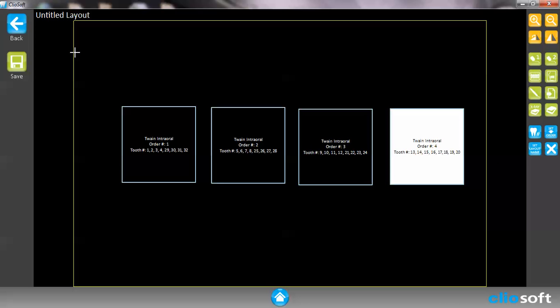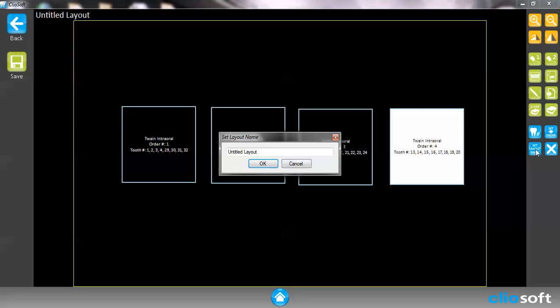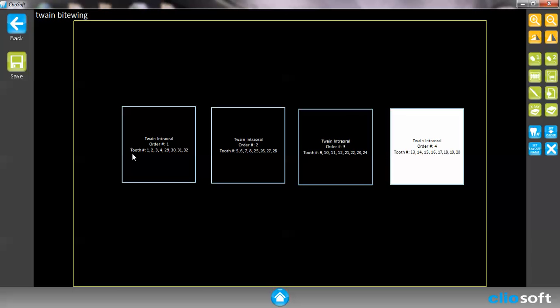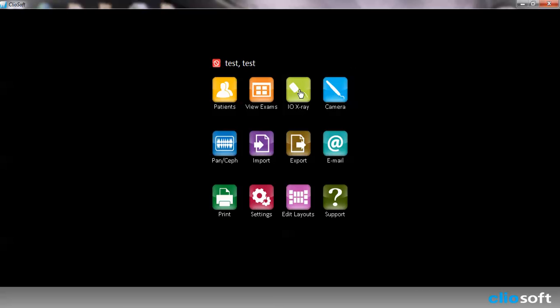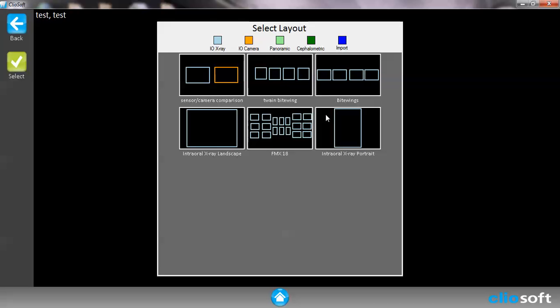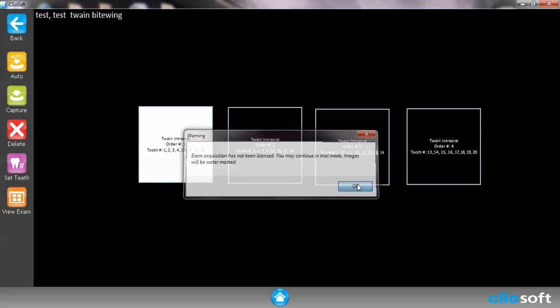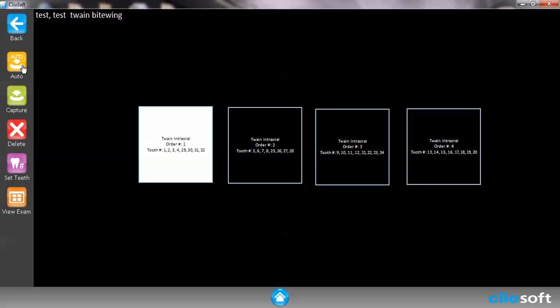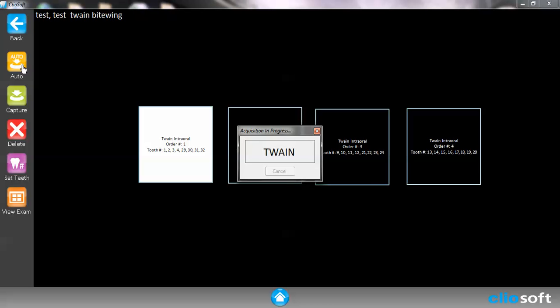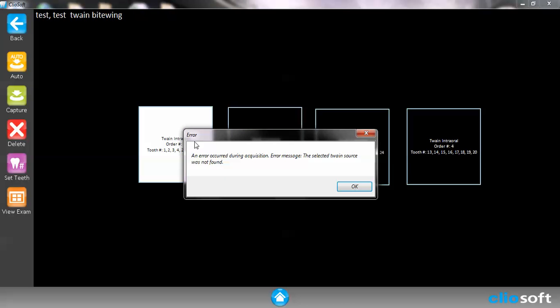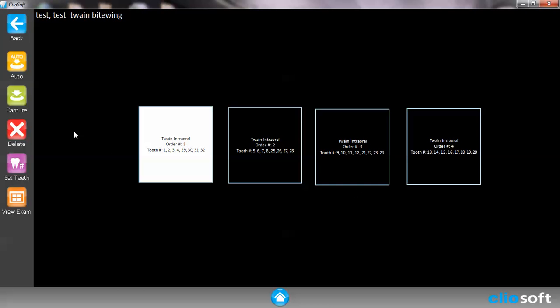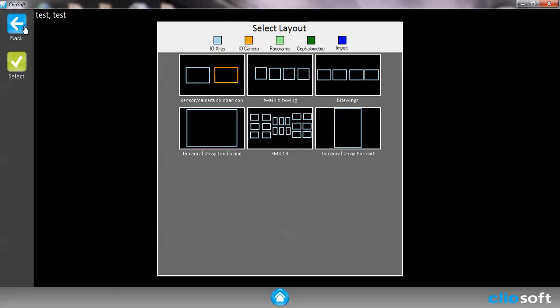I'm going to go ahead and name this my twain bite wing and save it. Once it's saved, I can go back in here. I see that my twain bite wing is right here. And I have the auto feature. Or if I were to hit auto, it's going to automatically choose it. Now I don't have a twain source, so it's not going to actually take the image. But that's just another way we can set it up.